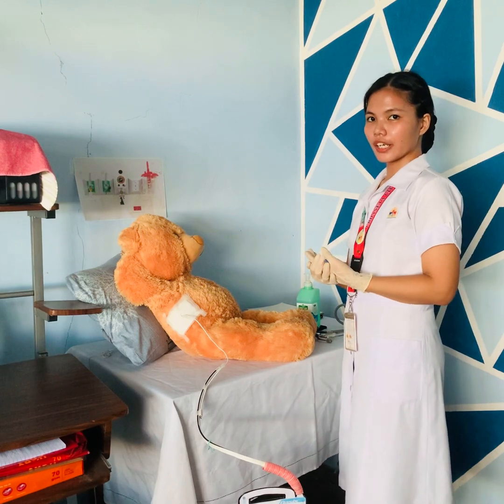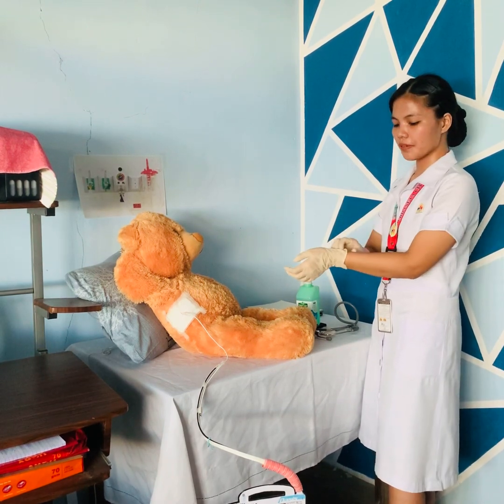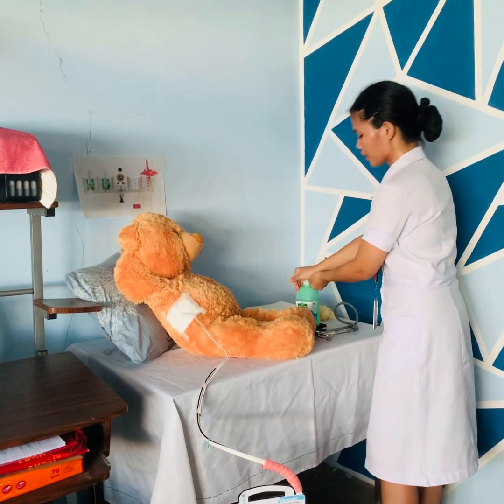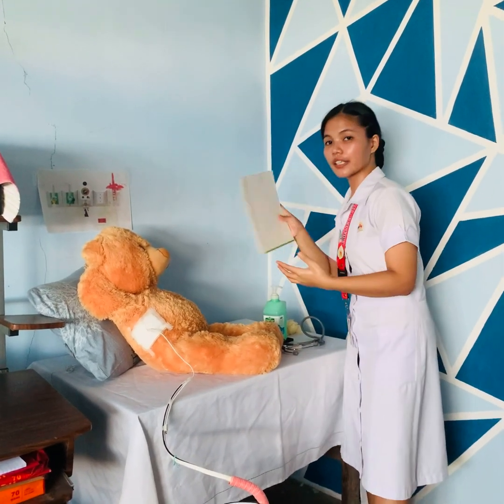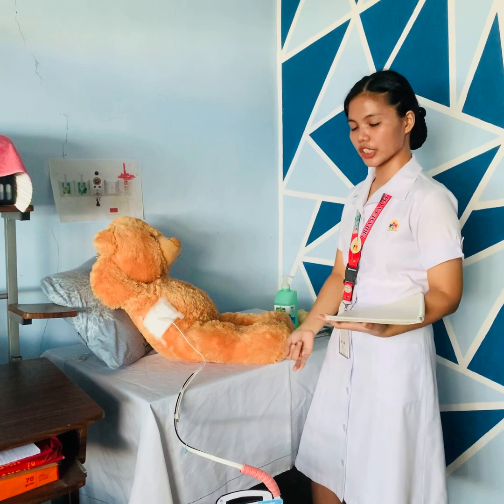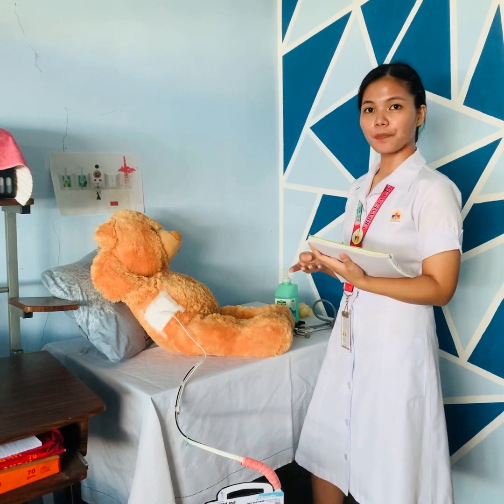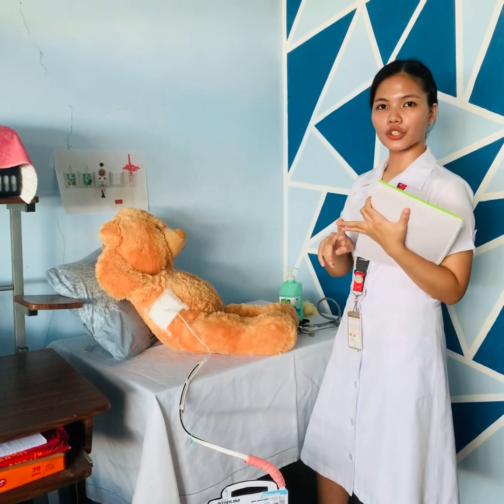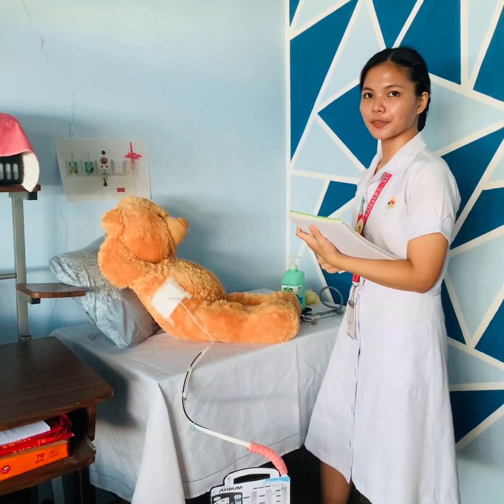After the procedure, perform aftercare: clean up, remove gloves, discard them, then perform handwashing to prevent the spread of microorganisms. Finally, document the assessment, including: presence of air leaks, fluctuation of water in the water seal chamber, amount of suction, amount and type of drainage, presence of crepitus, breath sounds, patient comfort or pain level, and the appearance of the insertion site and dressing.